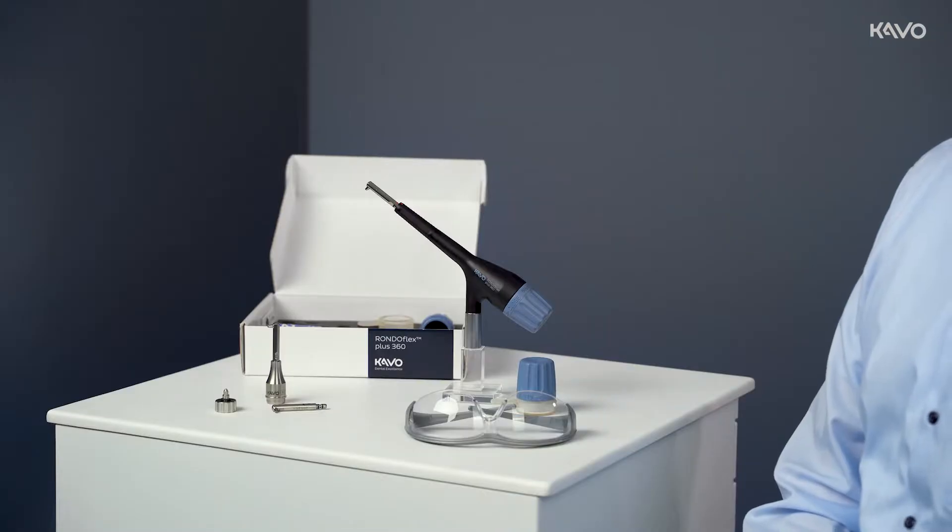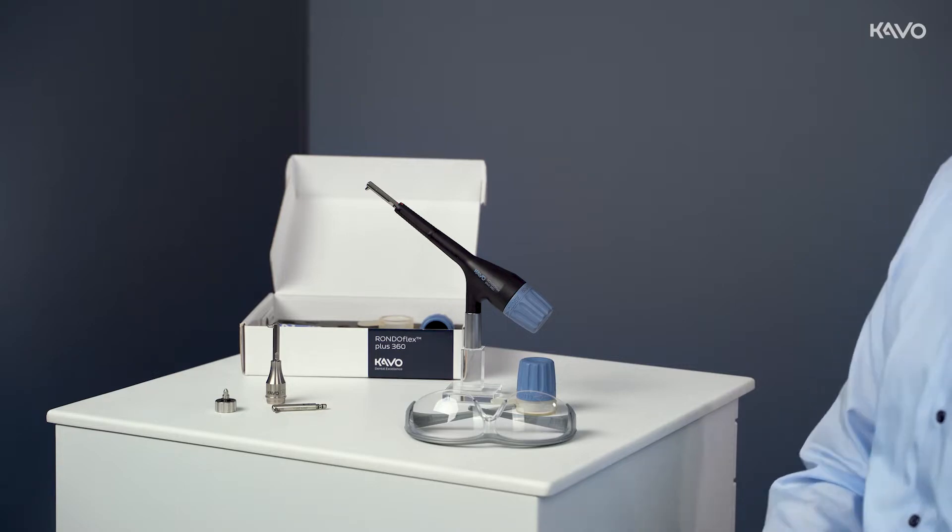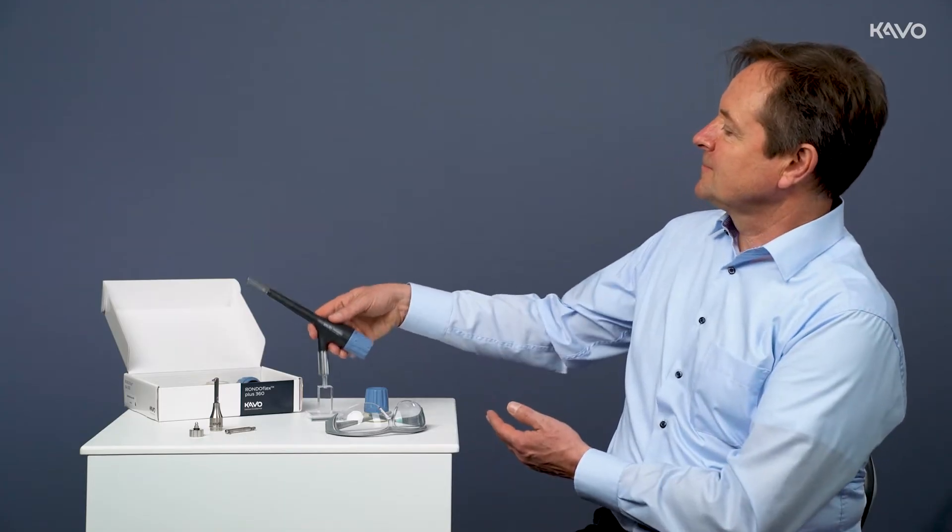In the following video we present the air operation unit CAVO RONDOFLEX PLUS 360. We show its use and operation as well as the reprocessing procedure.